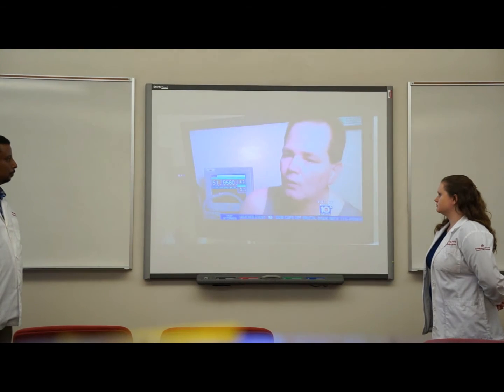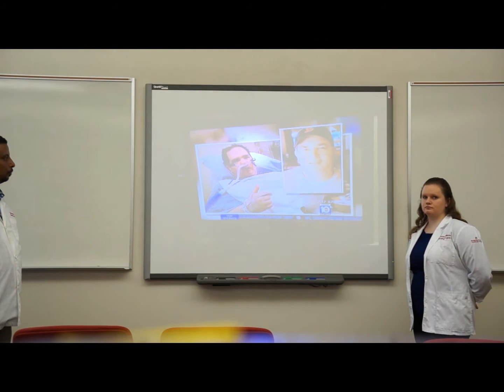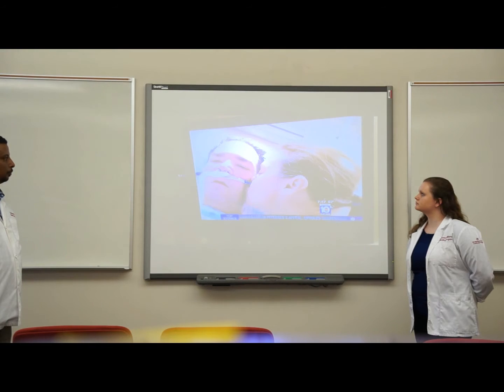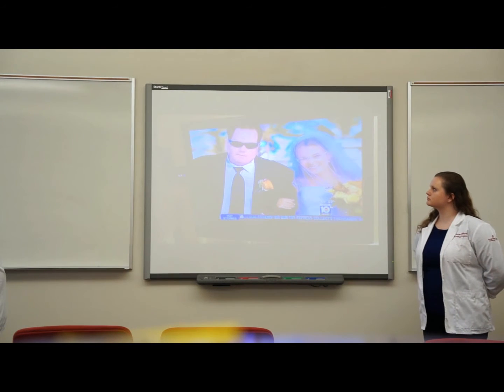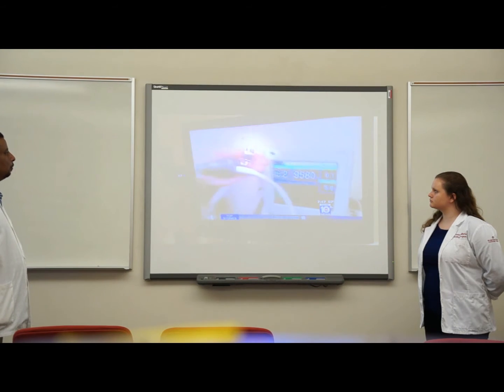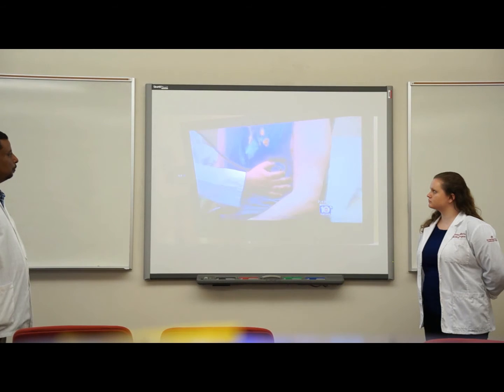It just got worse and worse because I couldn't move, I couldn't exercise. Ken Iovino's heart was failing, but overweight and bedridden, he was not a candidate for a heart transplant. Desperate for extra time with his family, Ken checked himself out of the hospital to walk his daughter down the aisle. They just said you were too heavy. We can't do it with you. But doctors did give Ken the Lvad, an implanted heart pump, hoping to give him a little more time with his family.